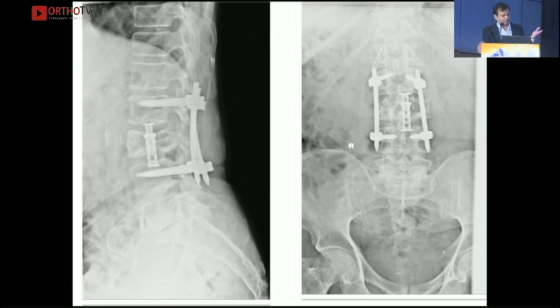So this is the challenge basically with the pacemaker, especially the modern pacemakers. You can change the mode and you can do MRI, you can use monopolar cautery. During that time you can change the mode and then again switch back to a synchronous mode. But this patient had the pacemaker introduced 18 years back. Otherwise we had to change the pacemaker, or then we go ahead with this. So that's what we did.